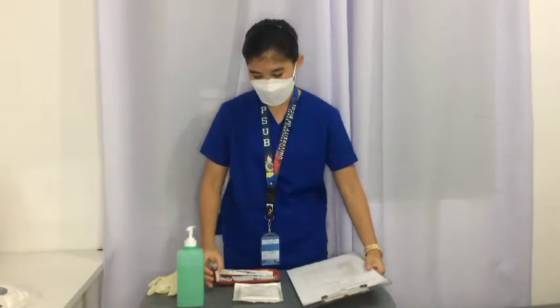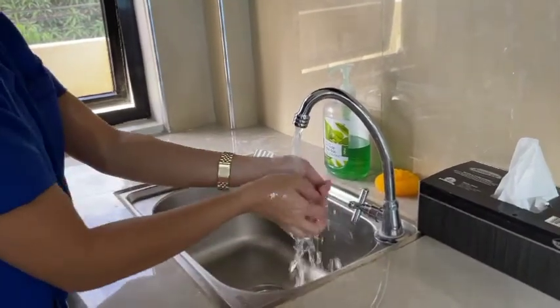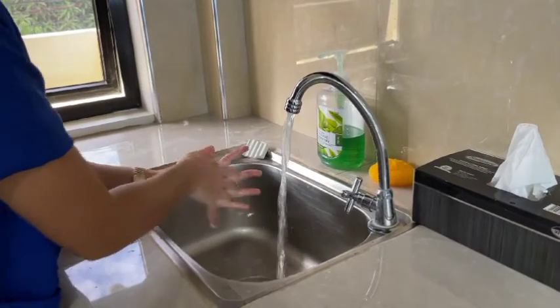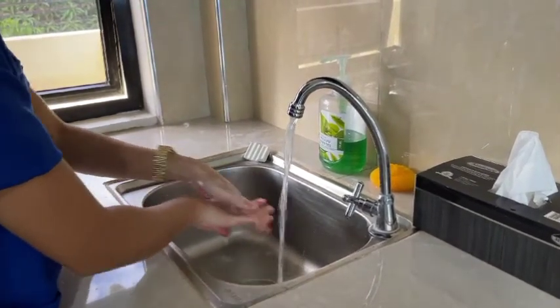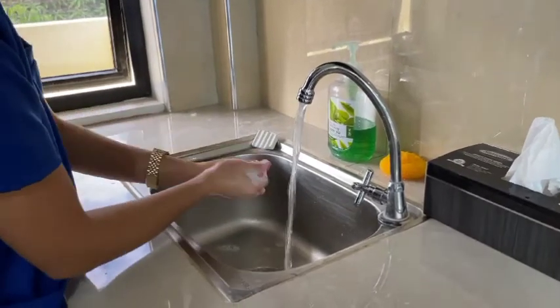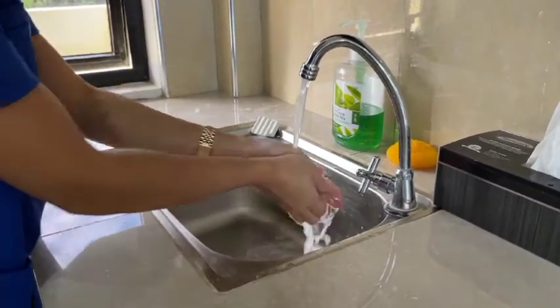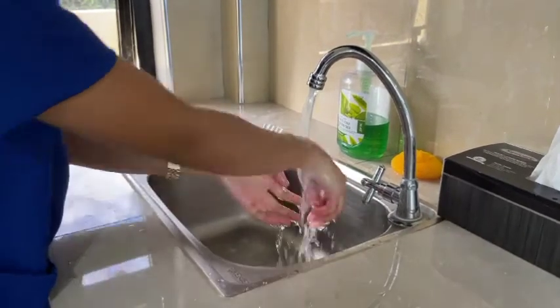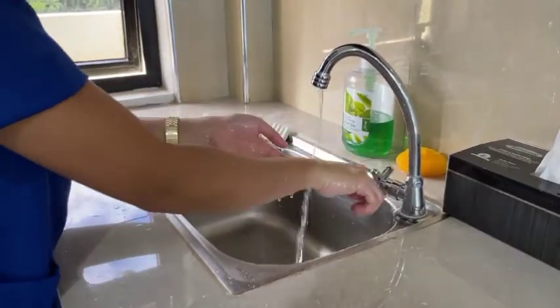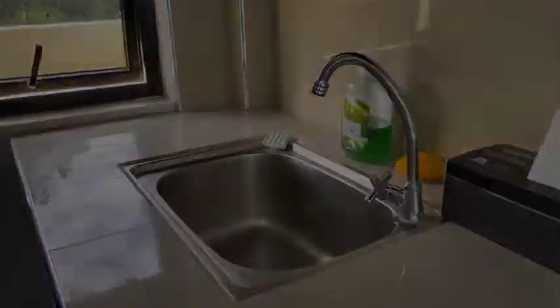So next is organize the equipment. So I've already organized the equipment. Now I'll perform hand hygiene and observe other infection control procedures. So next is prepare the medication from the vial for drug withdrawal.